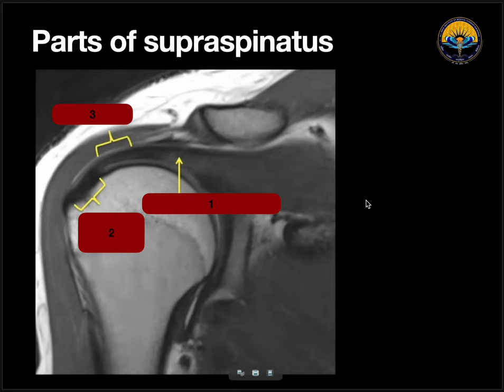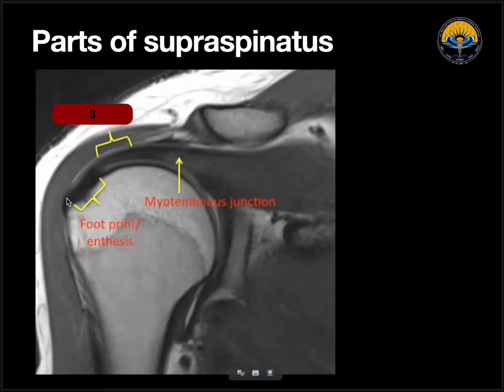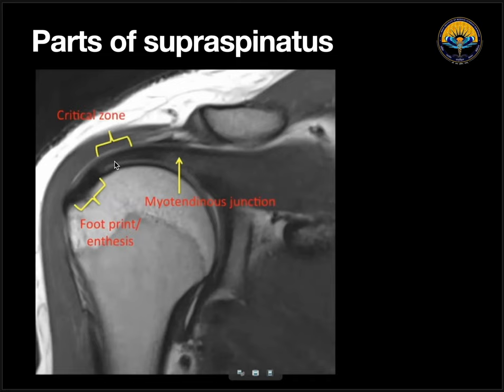On this coronal section, we can see the acromioclavicular joint, and below it, supraspinatus muscle going and inserting. Now looking at the various parts of this muscle: the first part is the muscle itself, then the tendon. The junction between them is the myotendinous junction. The second part is the site where it is getting inserted on the greater tuberosity — this is called the footprint or enthesis. The third part is around 1 to 1.5 cm behind the insertion, and this is called the critical zone. The critical zone is less vascular compared to the rest of the muscle, so this is the most common site of tears in cases of degeneration. However, if tears are secondary to traumatic etiology, the most common site is the myotendinous junction.